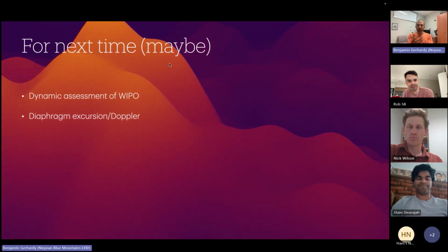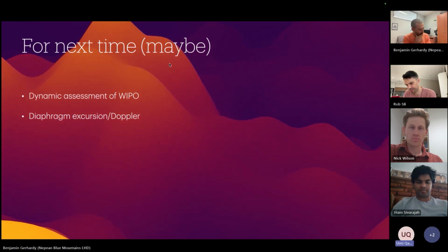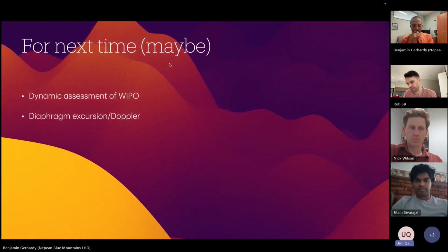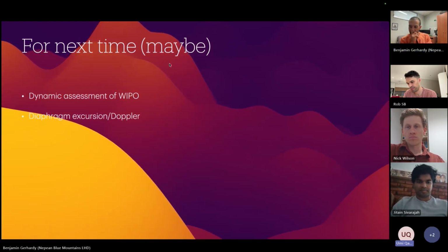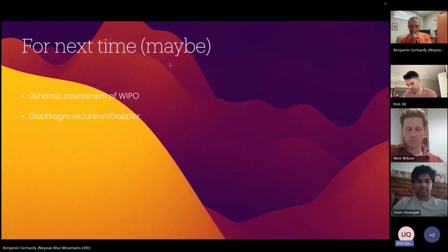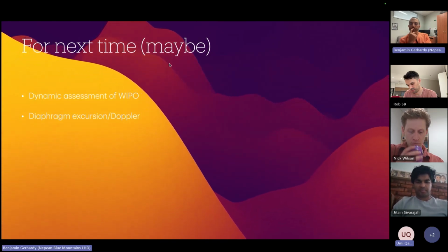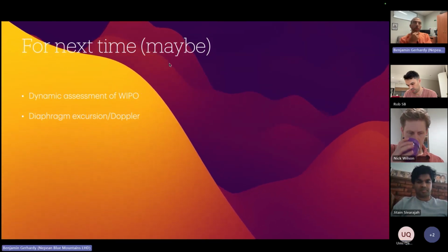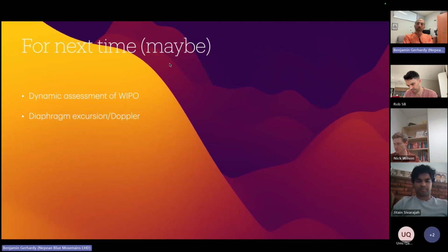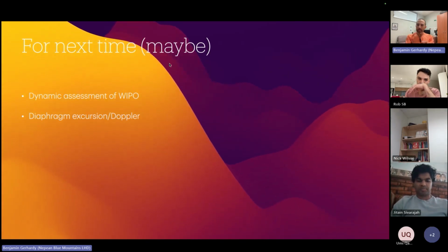So Ben, I've got a question. In one of the slides it shows someone with a normal X-ray, and then on the ultrasound you pick up these early signs of pneumonic processes. How specific is that? If you are able to elicit the sign on the ultrasound, will you be comfortable not going down the route of doing a CTPA, ruling out PE and other things? If I saw a bit of consolidation, so a normal chest X-ray and some consolidation or even B lines on ultrasound, I would be happy to not do any further tests.